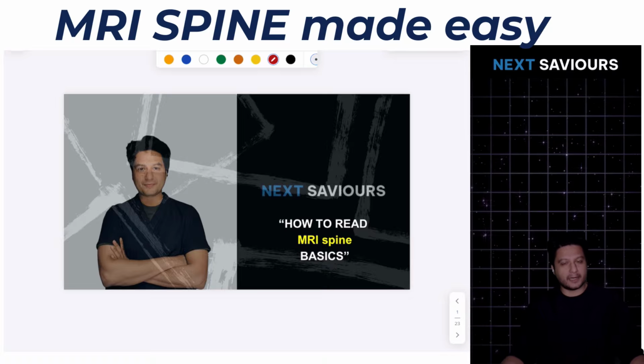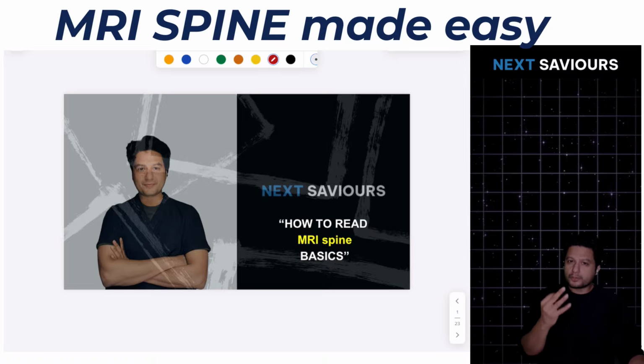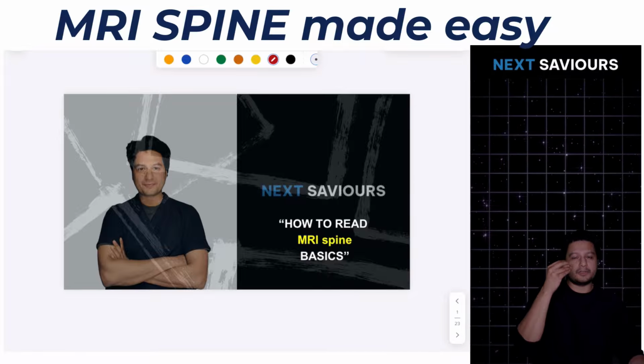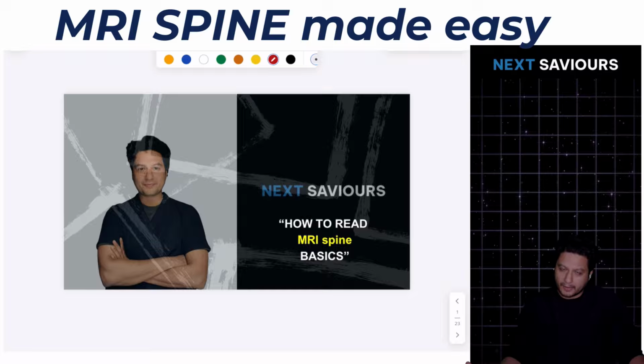So this is Next Saviors Clinicals. I am Dr. Yusuf Ali Tyagi. Today we are going to have a discussion on the three most important MRI of the spine, which are usually kept for your examination, for your assessment in NEET PG and FMGE exams.